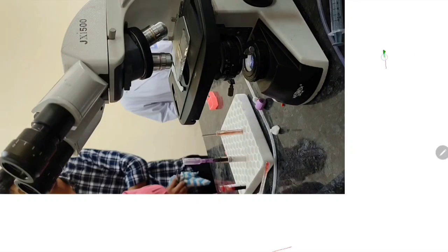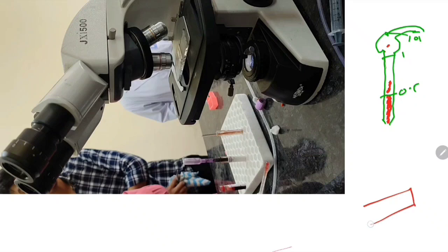This is the pipette. Okay, this is the bulb, and here we have the red bead. Here we have 0.5, then 1 and then 101, 3 markings, must remember. So first we will take blood. How much blood? We will take blood up to 0.5. If by mistake we take an extra amount of blood, then what we can do, we will take a slide or any hard surface.